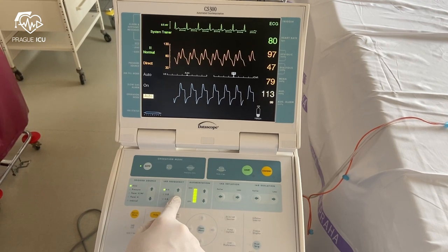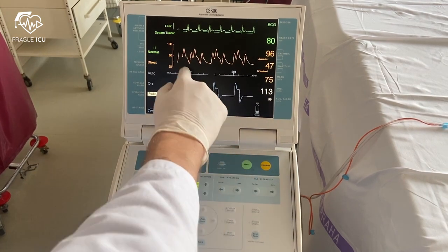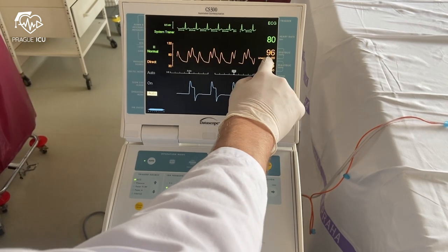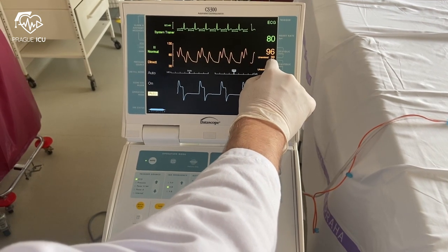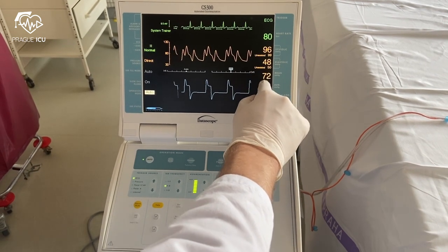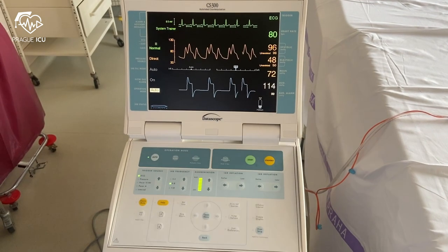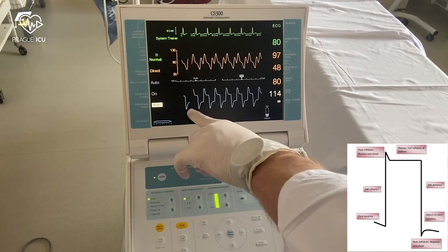If you change the frequency to 1 to 2, you can appreciate that only every second beat is assisted. On the right side of the screen, you can see that the assisted systolic and diastolic pressures are lower than unassisted ones. Augmented pressure is as high as 114 millimeters of mercury. Check also the augmentation waveform pattern. This is how it normally looks like.